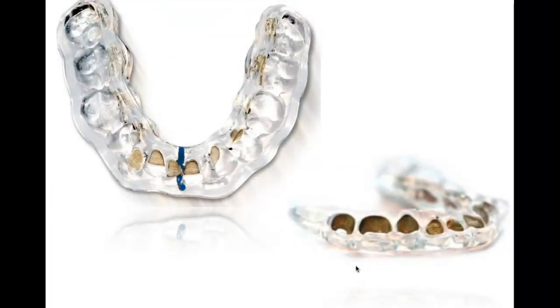So they create these trays, and these are made out of gold. And I guess the gold bonding properties was supposedly the best at its time. This was one of the OG players in the lingual orthodontic space, Incognito. For years, they were the only system people were using where, if you got good at it, you could get good results predictably. You could finish cases, you could do detail wires and things like that. It was the big player on the block.